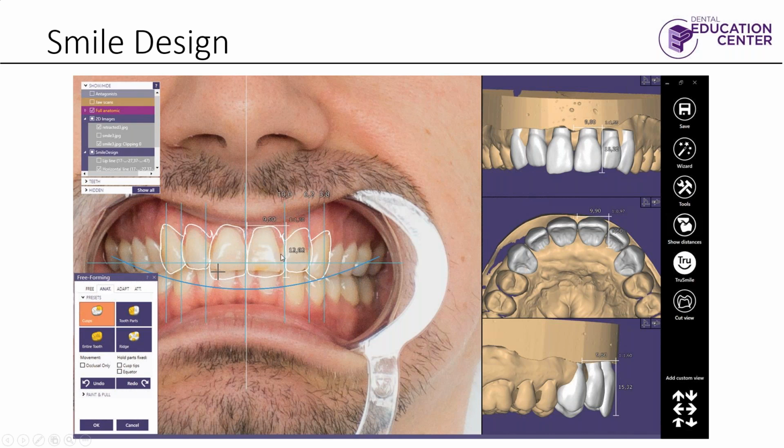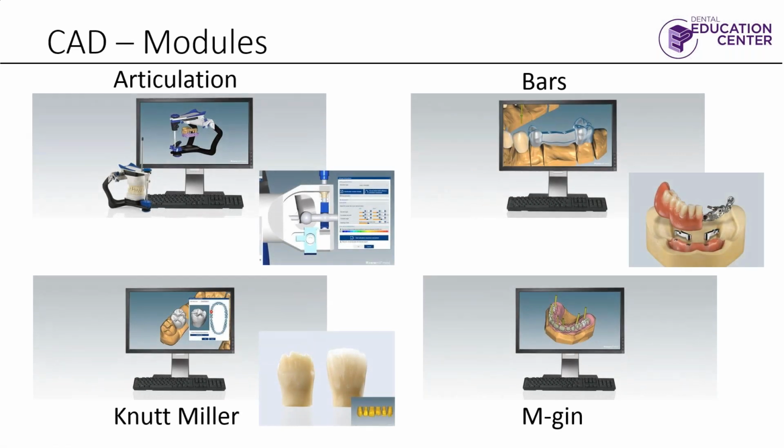The Smile Design software is nice. As you adjust everything on the right-hand side of your screen, it adjusts in real time in the patient's mouth, which is really nice, so you can show them exactly what they're going to be doing, what it's going to look like, your ideas for design, which is a lot of fun. There's a lot of times the lab can do this for you if you didn't want to do this, and then you could just use this presentation software. But actually, it's very intuitive, very simple software you could use yourself.